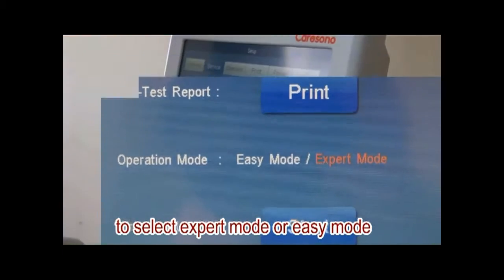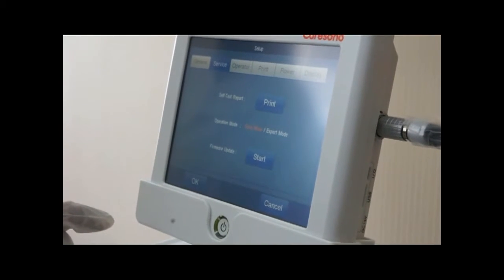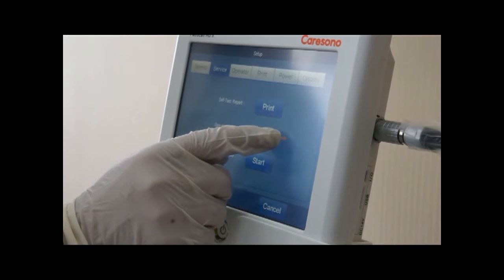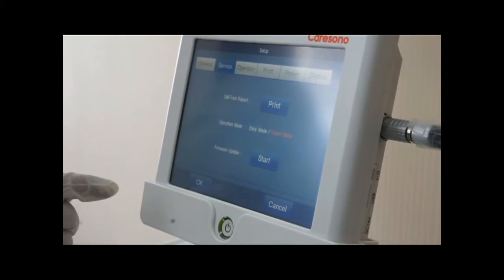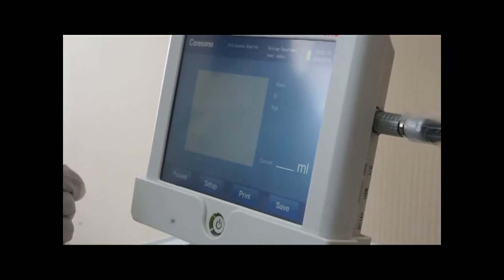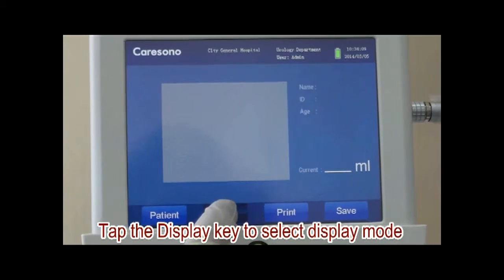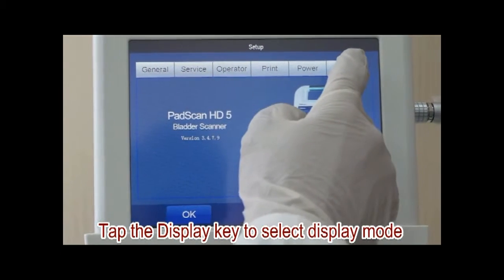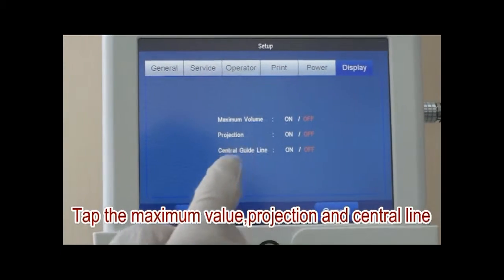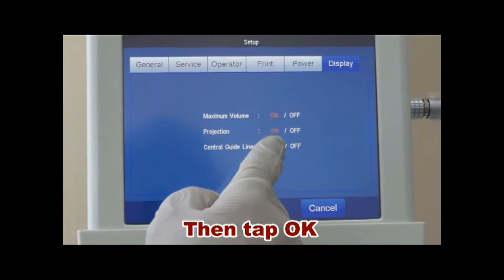To select expert mode or easy mode. Tap the display key to select display mode. Tap the maximum value, projection, and central line. Then tap OK.